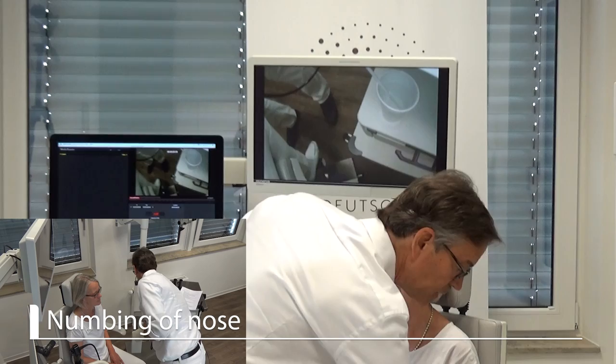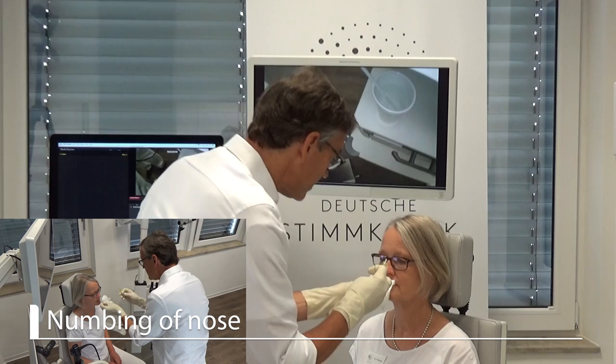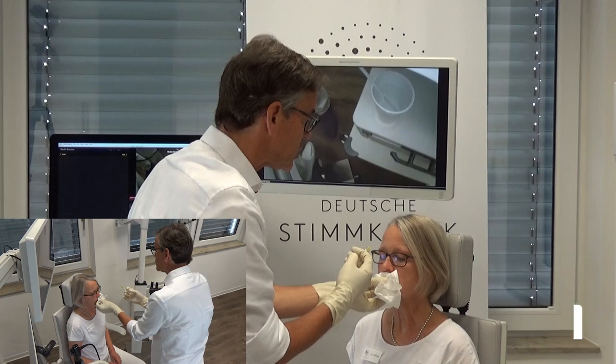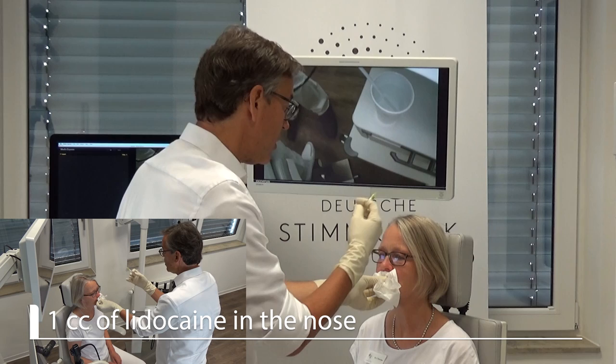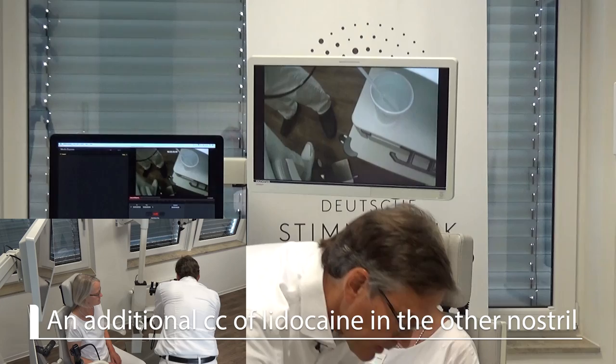I first want to numb the nose and I will take a tissue and ask the patient to inhale through the nose lidocaine, and not to drip it on the clothes — I will protect her. I ask her to breathe in. This was one cc and she will swallow it and sniff it in. Because I want to go all the way through, I will give her another one cc. Inhale, and now she is swallowing it.